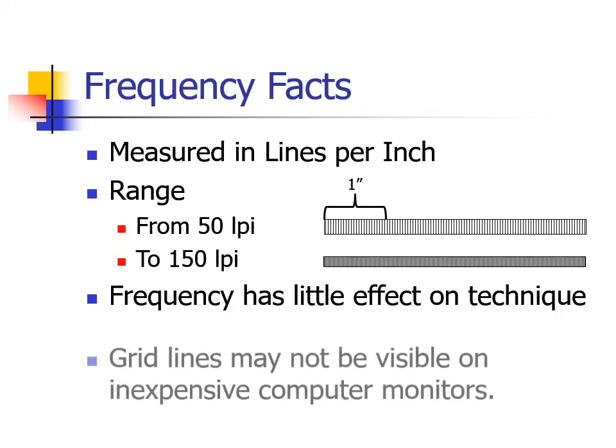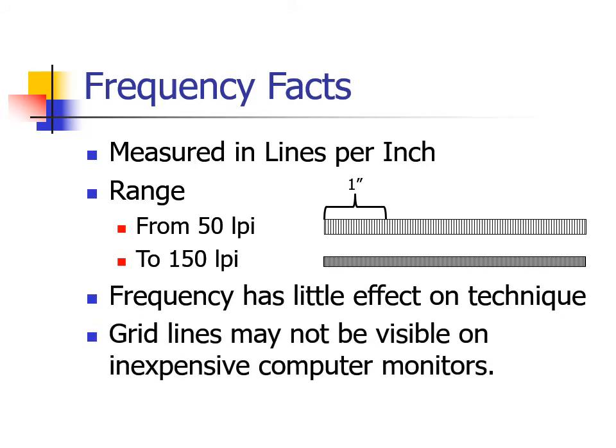Radiographers must be cautious when evaluating the impact of new grids by viewing images using inexpensive monitors, like the ones included with most radiology systems. These monitors don't have the resolution to demonstrate high-frequency grids. To do a proper evaluation of a grid's impact on the image, a radiologist's workstation must be used.